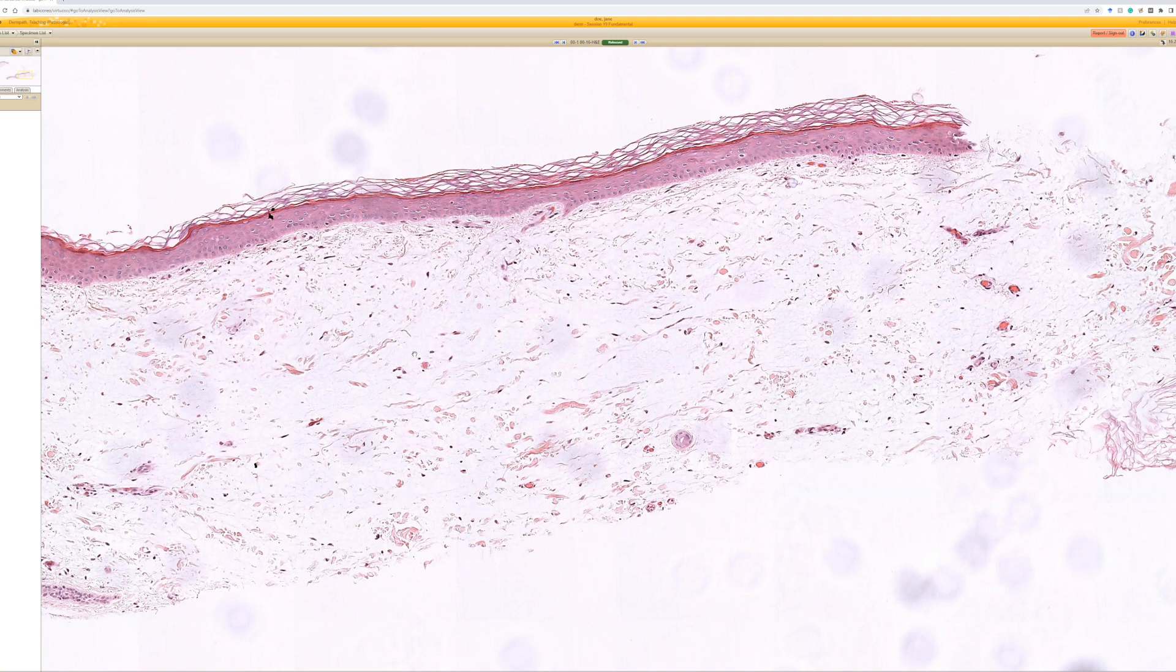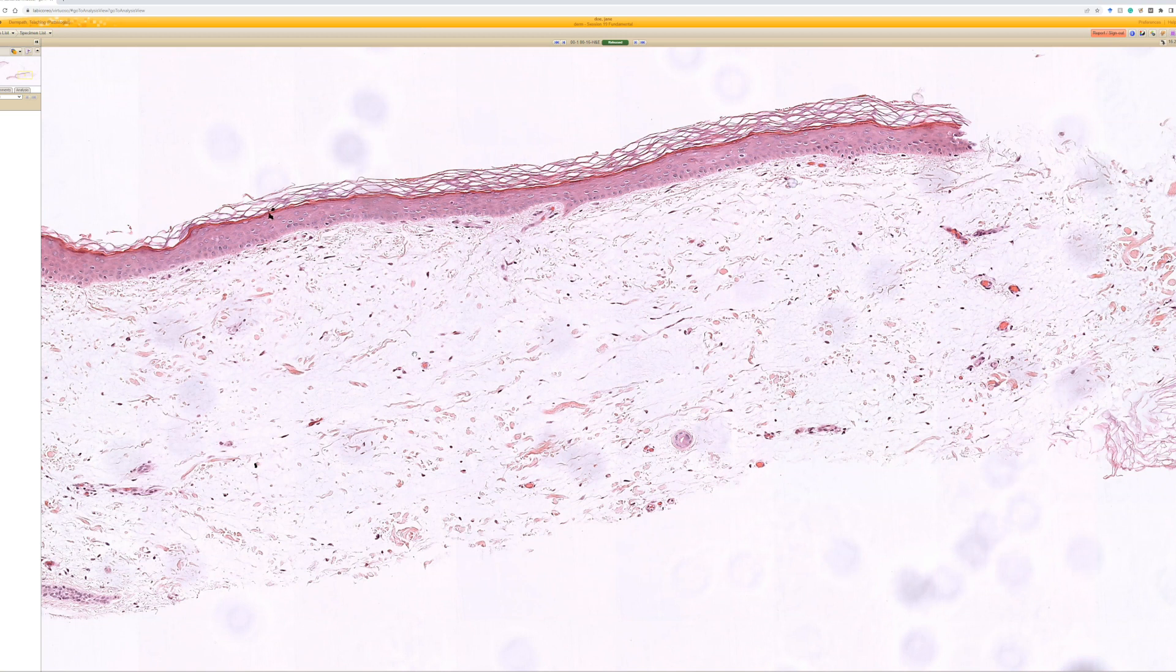And as the alternative name angiomyxoma implies, they usually have more prominent vessels. Sometimes they also have scattered neutrophils in the middle of them, or cystic hair follicles or sweat ducts. Not every case has all of those things, though.